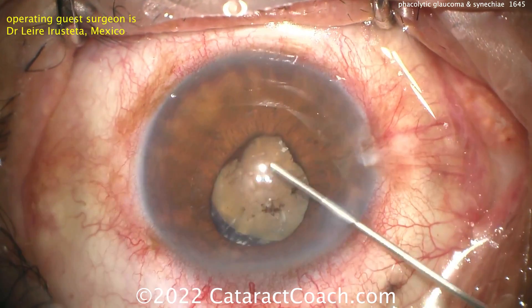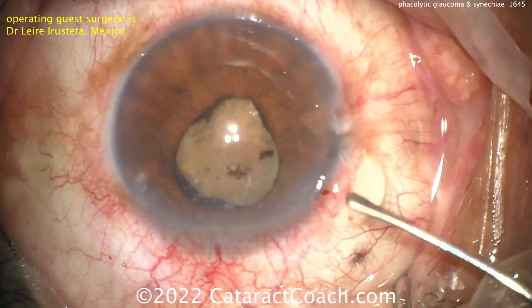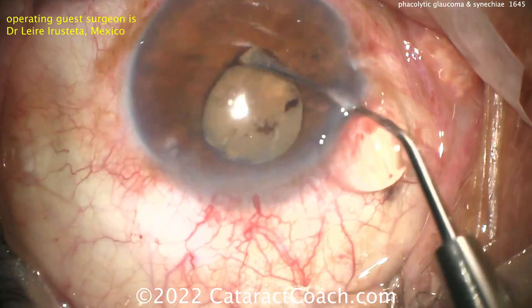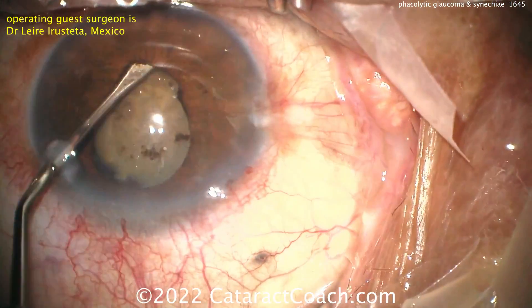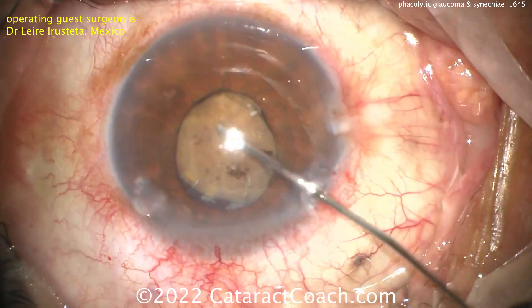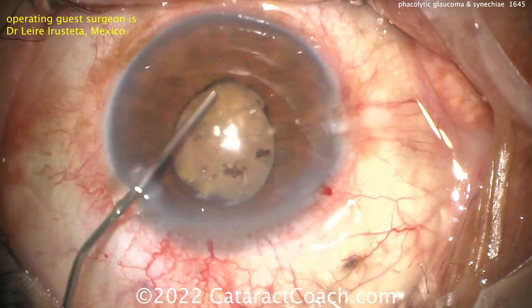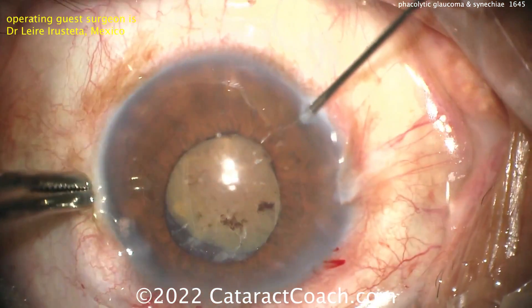Look at the bottom part of the screen — you can see that there's a gap in that capsular bag. This is probably liquefaction of lens cortex which seeped out; that's the facolytic part, and it's caused a glaucoma, caused all that sinechiae, caused a lot of inflammation. Now you have almost a more Morgagnian-type cataract where the capsular bag is partially empty, and that's what gives that crescent at the bottom of the screen.